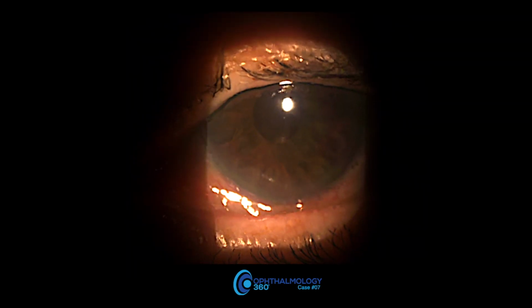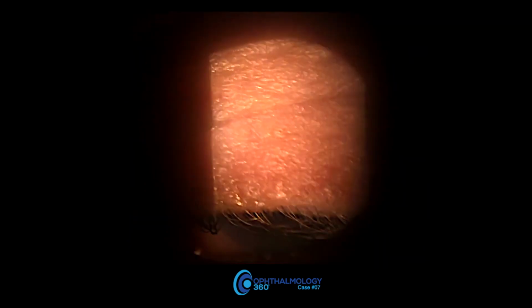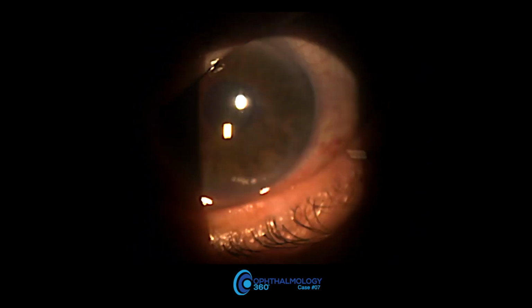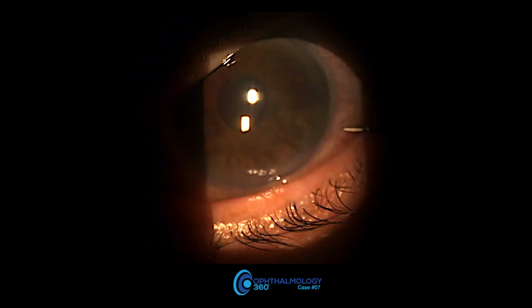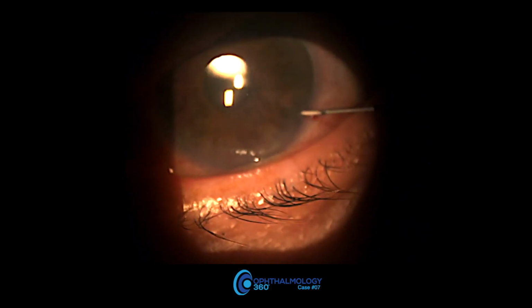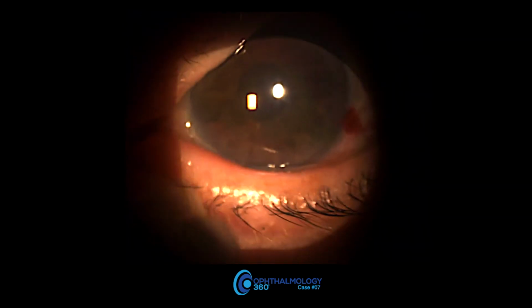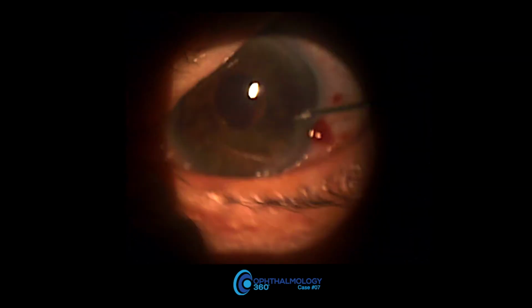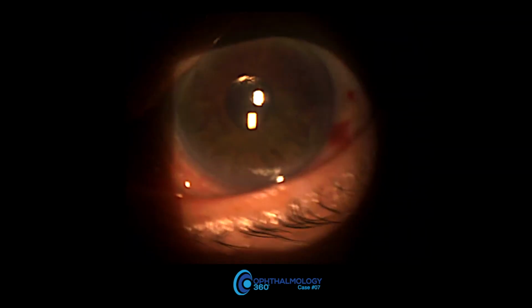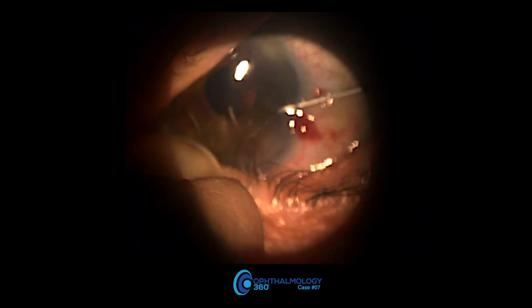So here's again a pseudophakic patient. You can see there's a lot of chemosis, a lot of injection in the eye from the topical medications. This is an ideal candidate for DURYSTA. So I'm talking to the patient the whole time here. I'm trying to use a Weck-Cel, and this is when I discover that the Weck-Cel is just not firm enough. It's one of my first attempts at this. So I started to use my finger, and if you don't get in right away or the patient's moving, just stand back and then go more clear corneal.